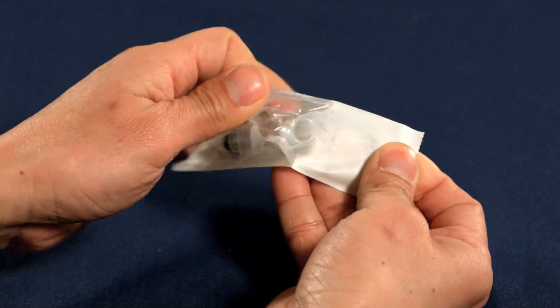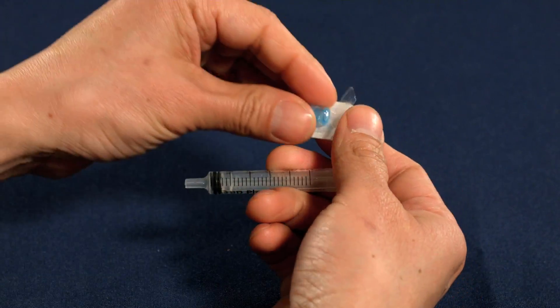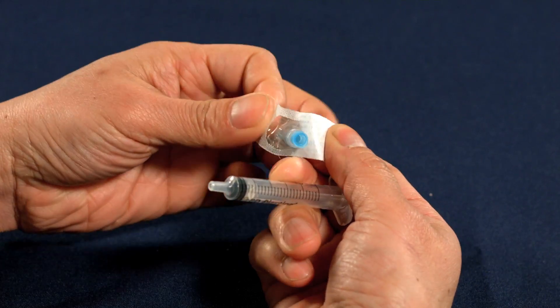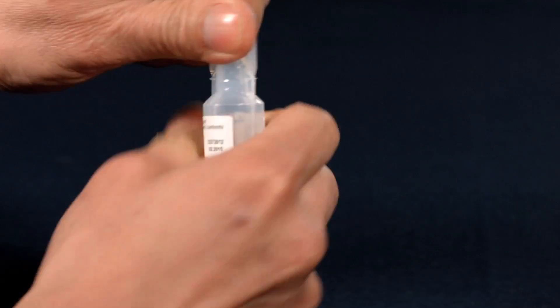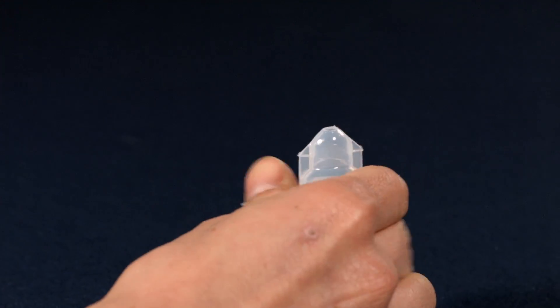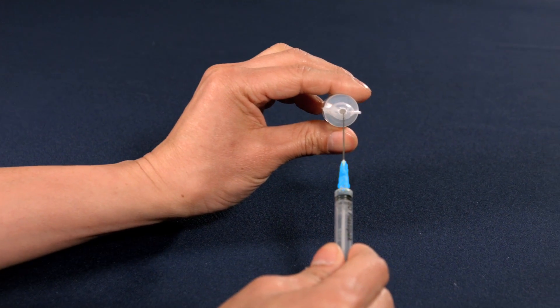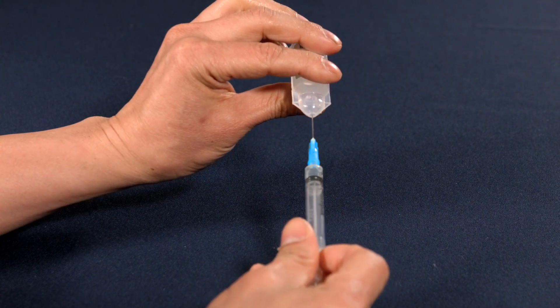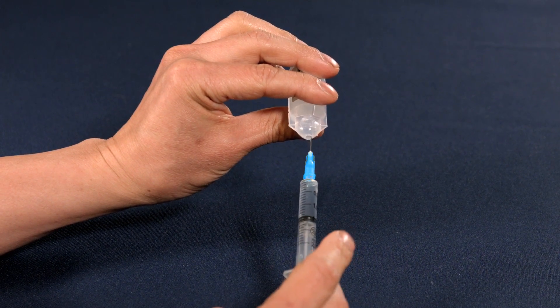Peel open the syringe and attach the needle by pushing firmly. Break open the water vial and uncap the syringe. Put the needle into the water vial and slowly draw up between one and two mils of liquid by pulling back the plunger.